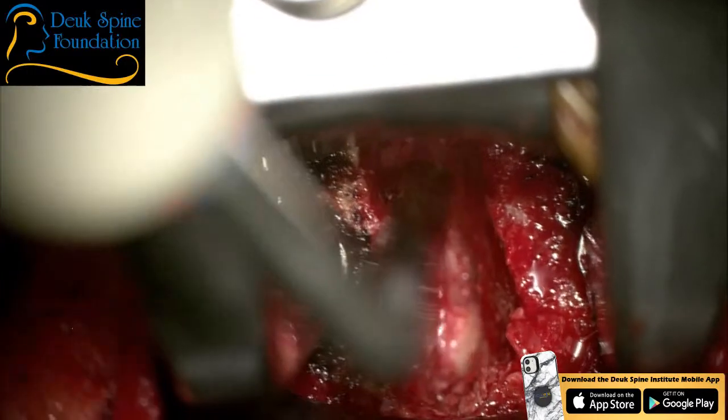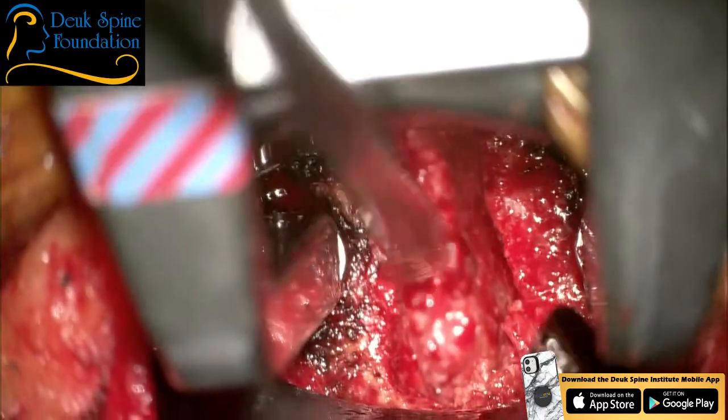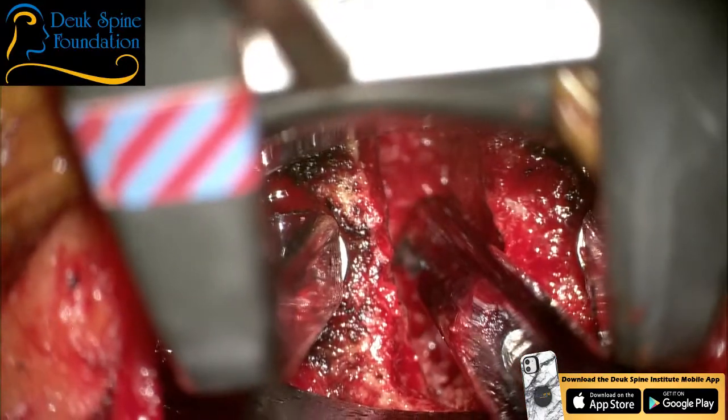So look how bad the pinching on the patient's right side is compared to the left. The herniation's worse over here on my side than it was on Dr. Patel's.